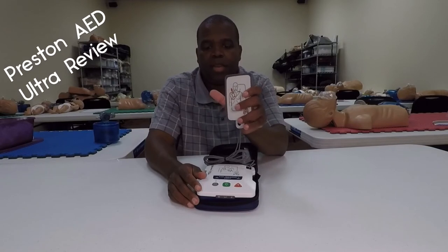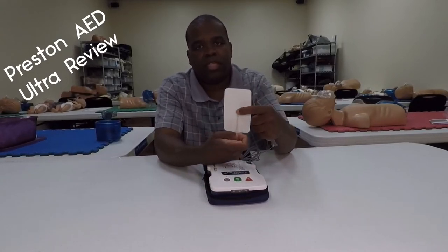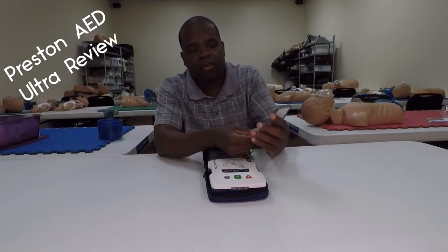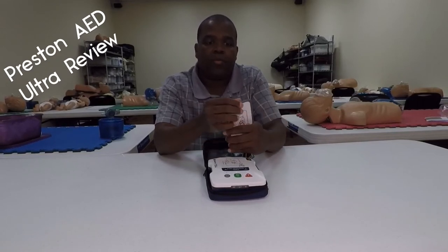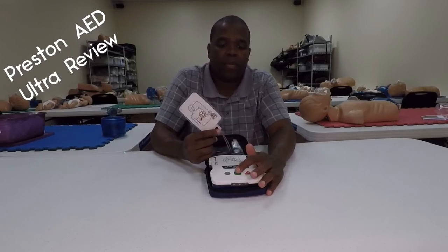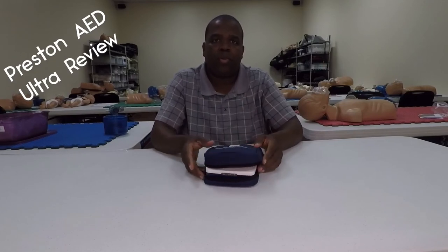Because it is a Prestan AED with the pads that typically go on the Prestan mannequin, it still has the same concern I've had before: there's a little sensor on the pad that has to be on the mannequin. If you have a softer mannequin, such as the Sandy Man, you may have a little bit of a difficult time getting that pad to actually read on that mannequin. It's ideal for the Prestan mannequin and also ideal for any other hard mannequins you utilize. Some softer mannequins — like CPR prompt mannequins or Sandy Man, especially older ones that aren't as rigid — you may run into a little bit of difficulty.